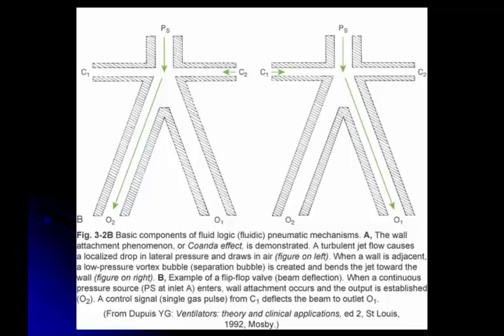Okay? So all I'm doing is I'm using pneumatics to control ventilation. And there's some kind of logic that's telling the machine, go from C1 to C2, to C1 to C2. It's just internal logic. What causes it to switch? Some kind of timing mechanism internal to it says, stop going from C2, go to C1 to deliver breath to the patient. Then after a certain inspiratory time, it knows it's supposed to flip itself back. Those are all internal logics that are created within it. So it's time-based? In this case, it could be time-based. Okay?